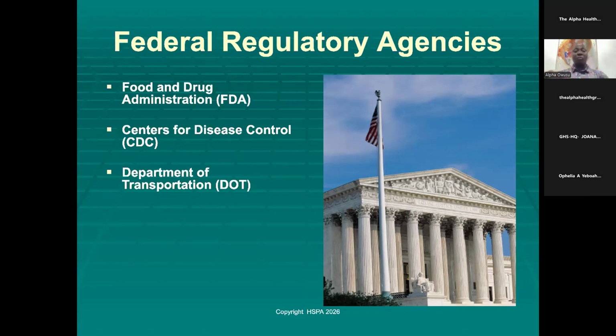You cannot just hold them in your hands. What if you are holding them and you bump into somebody and then it all gets on the floor? What are the regulations, the step-by-step processes that you use to mitigate this, per risk management, infection control, quality? Very, very important: transport. And so what is the mode of transport? Do we put it in a containerized, sealed container so that it doesn't soil? What is the transport agency? What are the regulations for it? Very, very important.